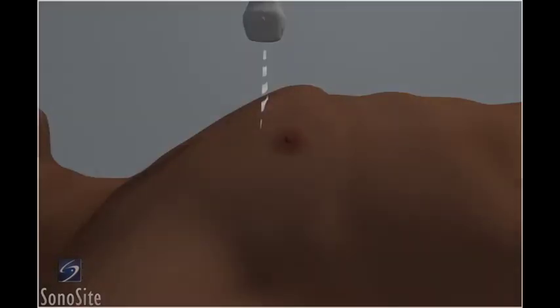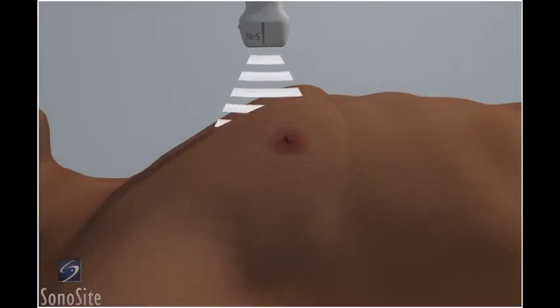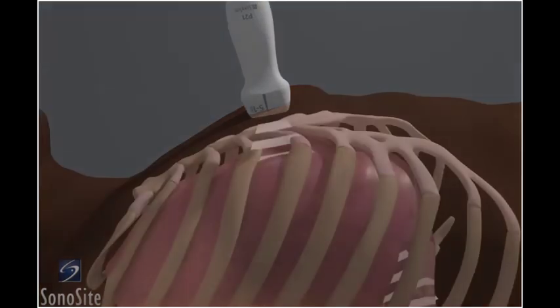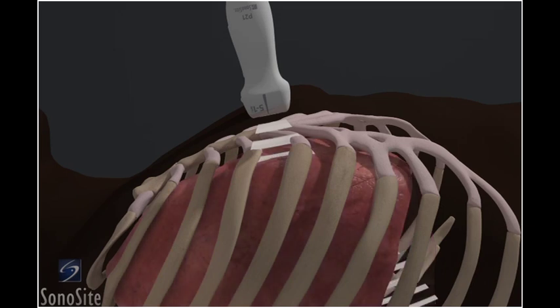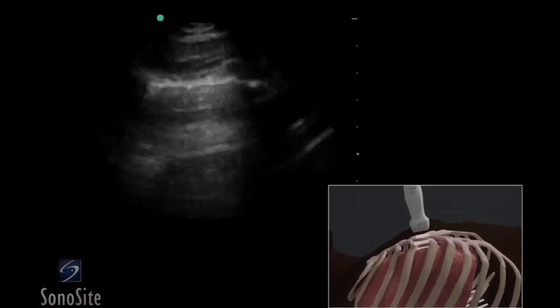The transducer is placed in a long axis orientation over the anterior chest wall at the third or fourth intercostal space in the anterior axillary line. The orientation marker is directed to the patient's head. A shallow scanning depth is used.